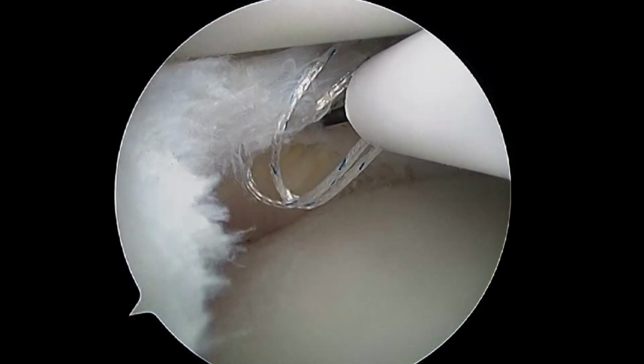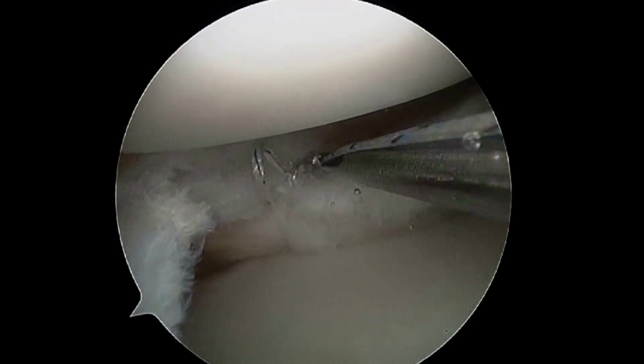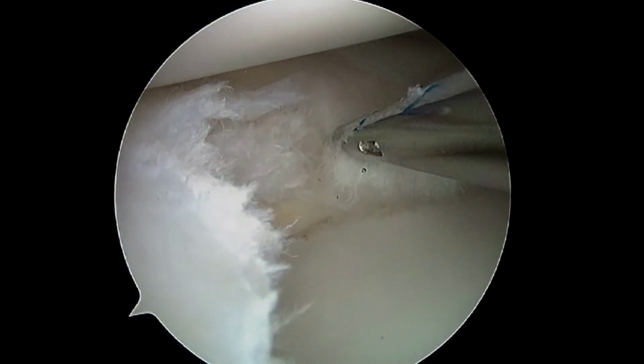A Fast-Fix meniscus system is used. The needles are delivering implants above and below the meniscus, in a vertical fashion. As the knot is tightened, we can observe the fixation of the meniscus.